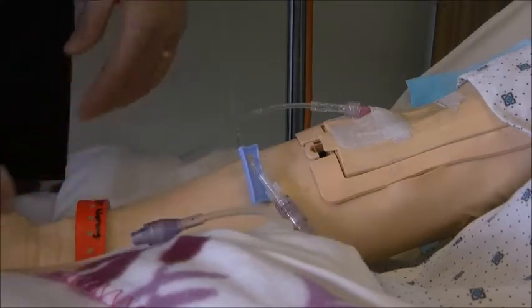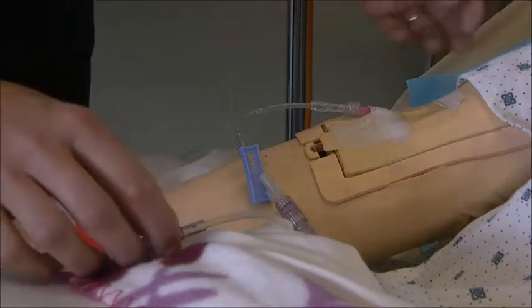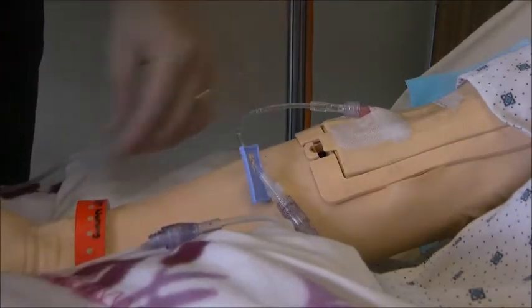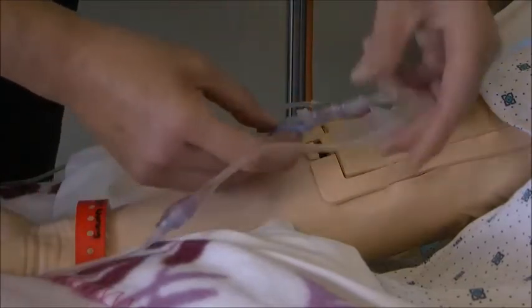If you have any issues with an IV stopping or kinking, just make sure that you start from the top and make sure you go all the way down, follow the line down, so that you can find out where the occlusion might be. It generally is just something simple like right here.